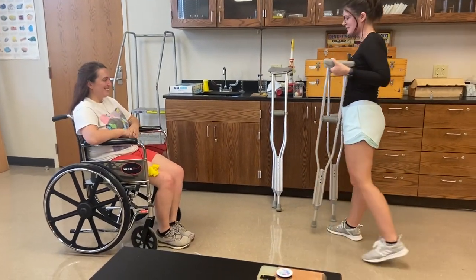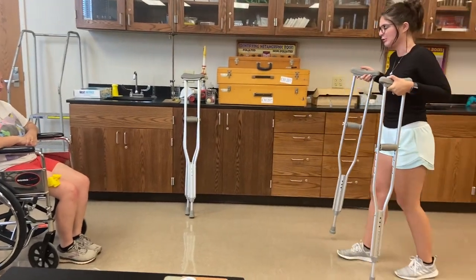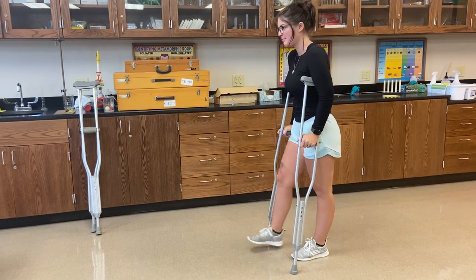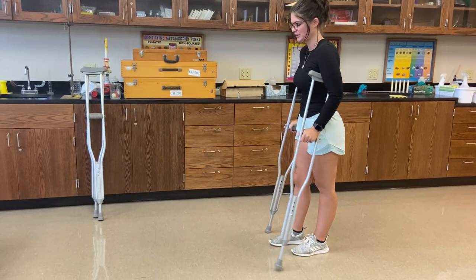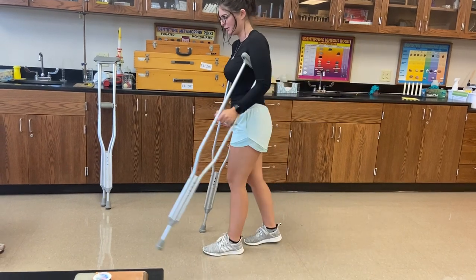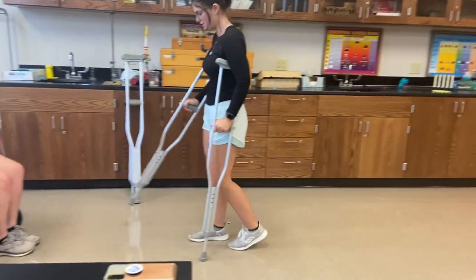So the first thing we're going to start off with is doing a four-point gait. It's going to be your bad leg and crutch — crutch, bad leg, crutch, good leg. Crutch, bad leg, crutch, good leg.